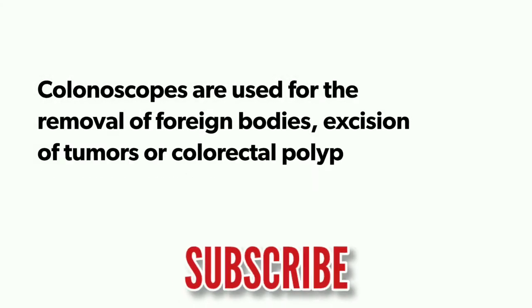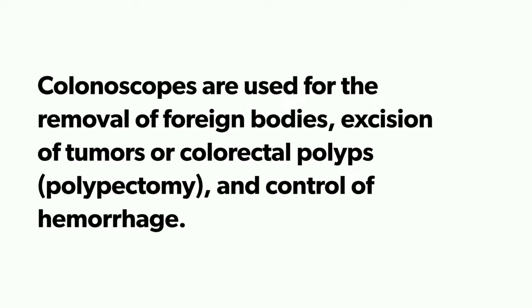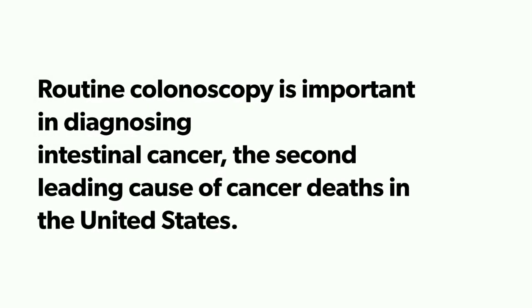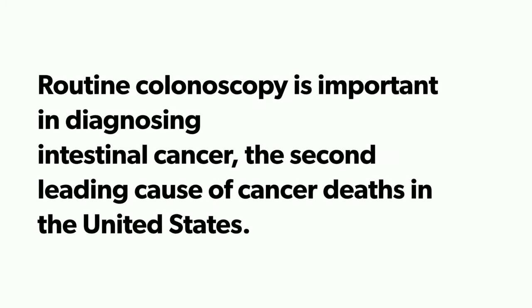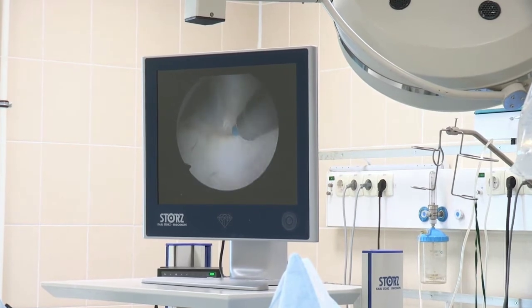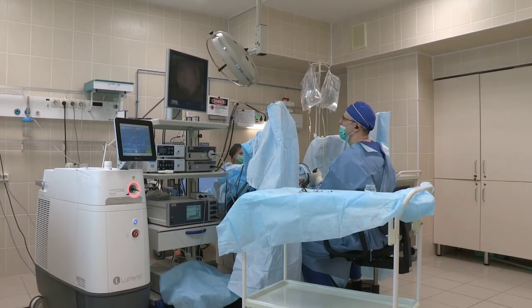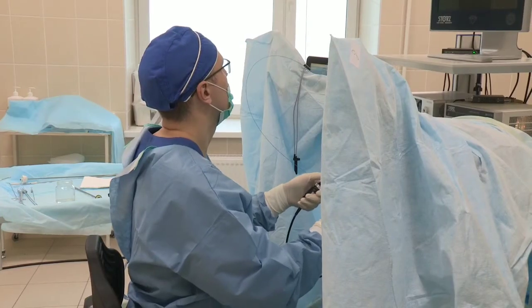Colonoscopes are used for the removal of foreign bodies, excision of tumors or colorectal polyps, and the control of hemorrhage. Routine colonoscopy is important in diagnosing intestinal cancer. The second leading cause of cancer deaths in the United States is intestinal cancer. So guys, these endoscopic procedures reduce the need for invasive surgical diagnostic and therapeutic procedures. So in this, I have talked about what this equipment looks like. Let's talk about how this operates.